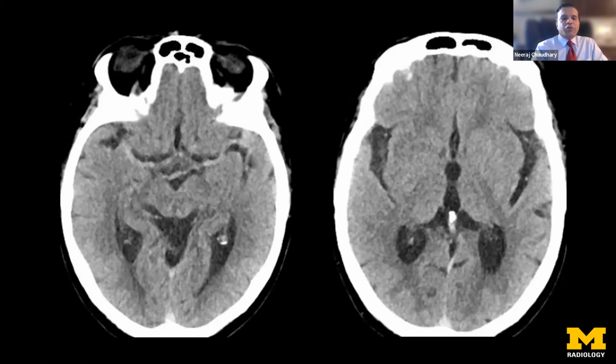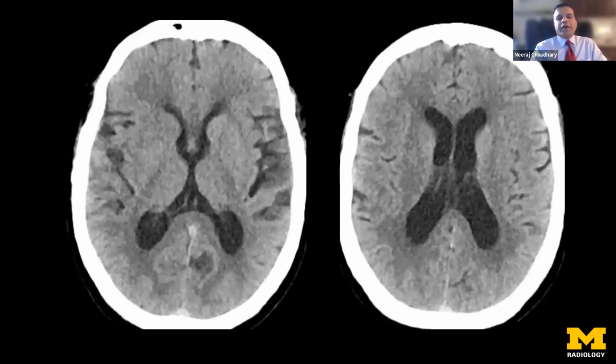So in any acute ischemic stroke, suspicion based on clinical grounds, as we see, the first port of call is to do a non-contrast CT head, and that is to exclude hemorrhage. You don't want to be giving patients clot-busting medication if there is hemorrhage as the etiology for their predicament of neural and functional loss, be it hemiparesis, be it speech loss, as we know from a presentation of acute ischemic stroke. So once we have excluded hemorrhage, we go on to be identifying how much is the damage.